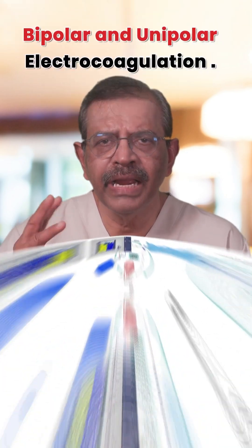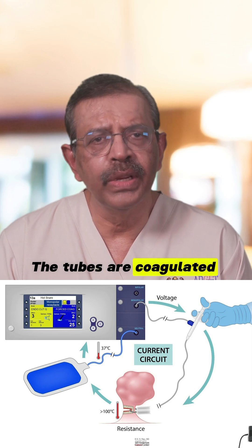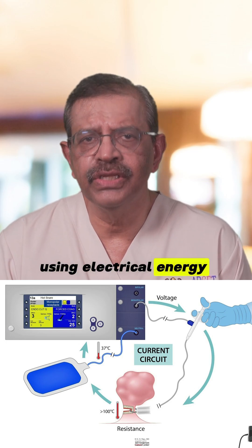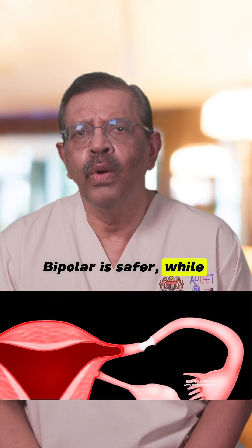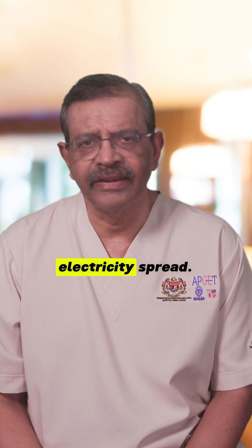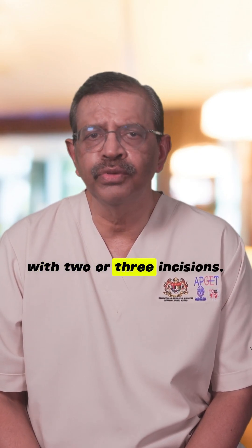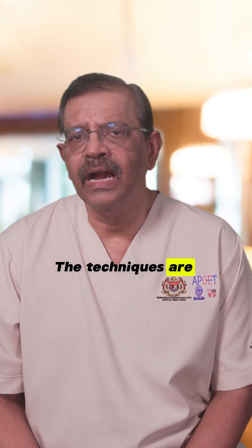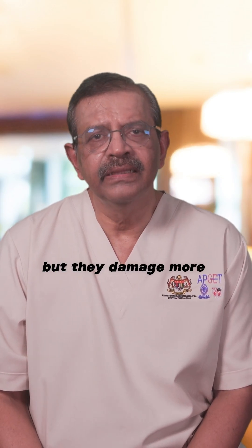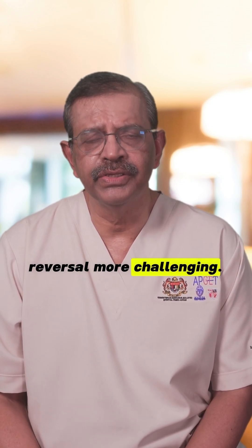Number 3: Bipolar and unipolar electrocoagulation. The tubes are coagulated using electrical energy, with or without transection. Bipolar is safer, while unipolar may cause more tissue damage due to lateral electricity spread. Both can be performed with two or three incisions. The techniques are cost-effective and easy to perform, but they damage more tissue, making tubal reversal more challenging.